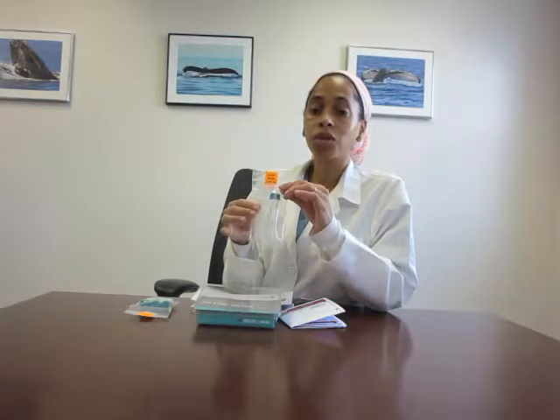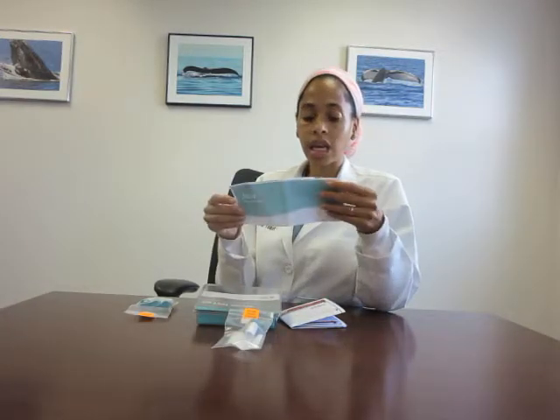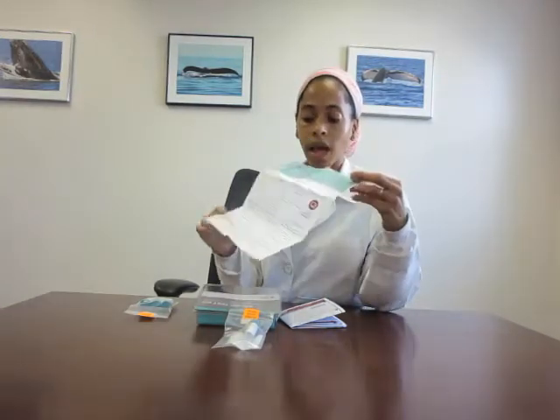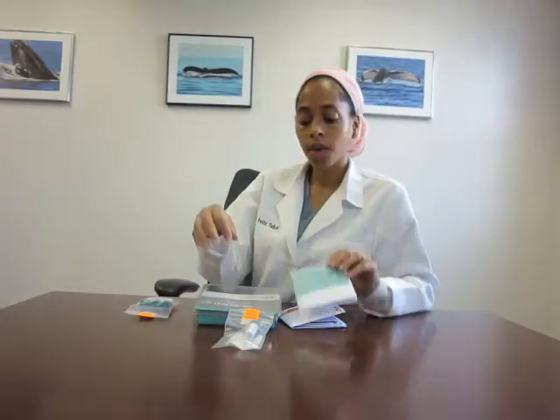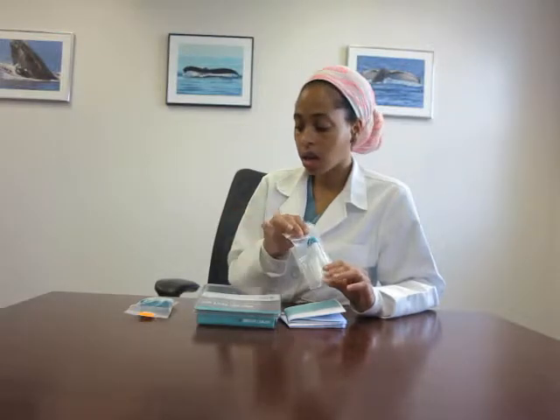So when you first wake up, do not brush your teeth before you take your sample. The instructions have everything in here, and there are two sides to the instructions. If you have any questions, don't hesitate to call us at 295-5100 — one of the ladies at the front desk will be happy to help you navigate any questions that you are having.